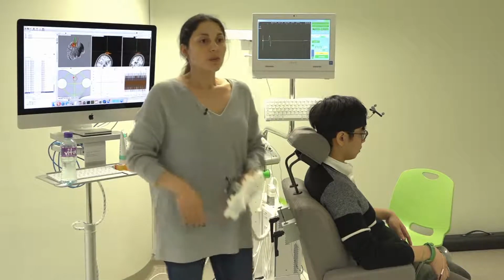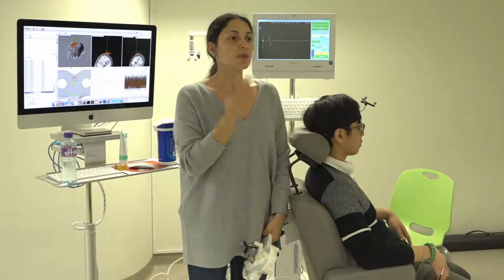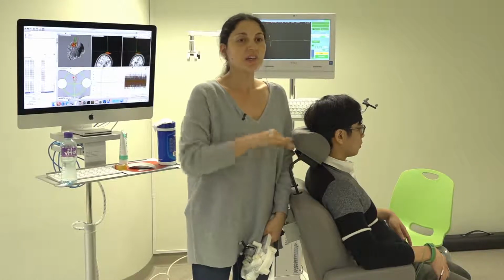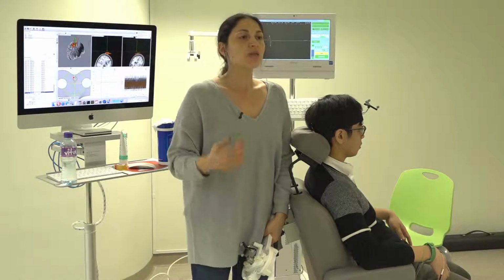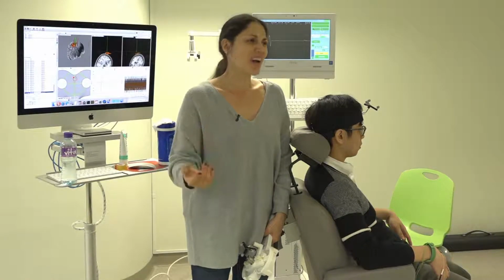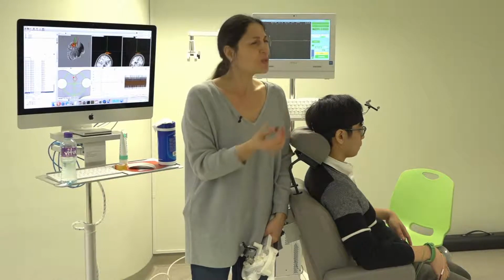Okay, so I can reproduce it. No matter, sometimes you will have this experience where you ask the subject to relax, and you will have no presence of MEPs because the subject is relaxing. So the MEP is really highly variable depending on the person's mind, and it really works like that.